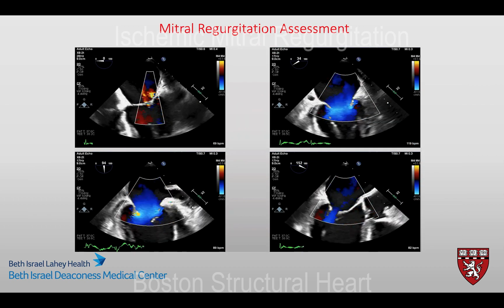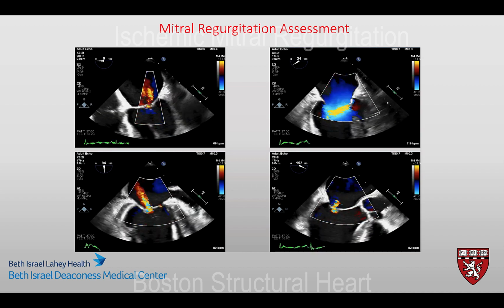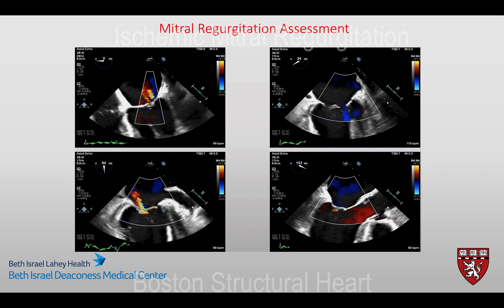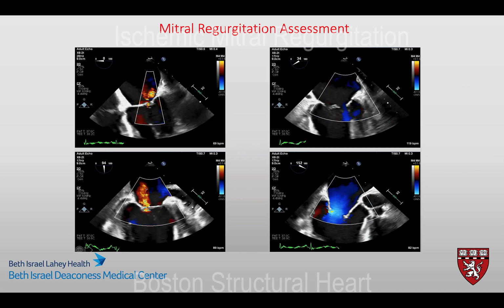He presented to the operating room for coronary artery bypass surgery, and after an uneventful induction of anesthesia, we performed our transesophageal echo examination of the mitral valve. And our assessment of the mitral regurgitation was that it was mild to moderate in nature.